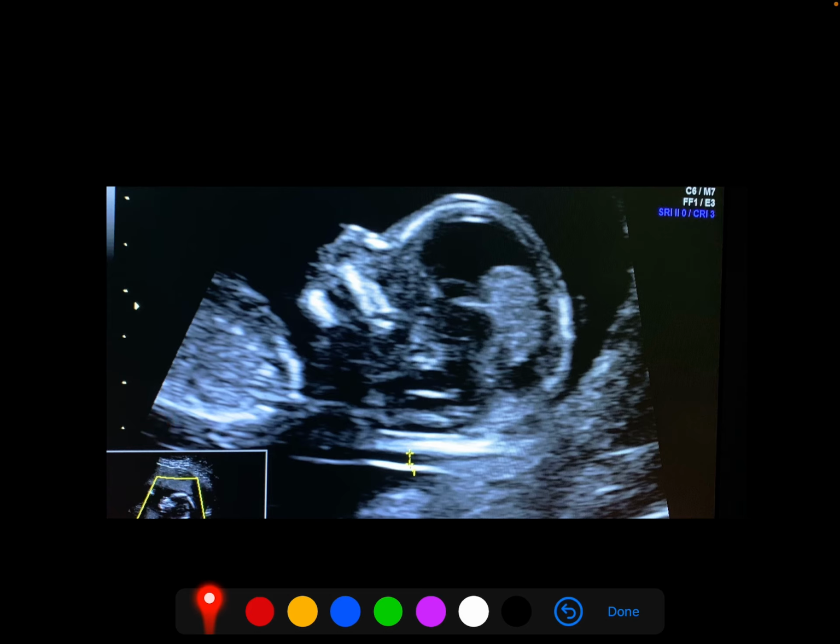And to say whether it is a mid sagittal or not, you have to see the nasal tip, you have to see the diencephalon, and above palate there should not be any maxillary bone lying over there. So after getting the mid sagittal and zoomed in images, you have to assess three structures in the nasal region.